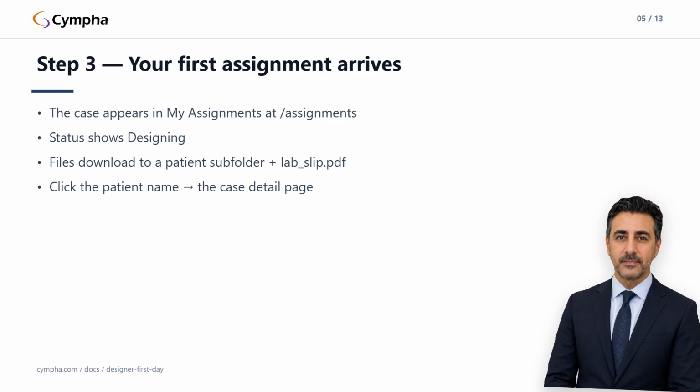That's the next slide. Give the case detail page a full minute. It repays it. The case parameters are what the doctor actually specified: plan ranges, extractions, materials, anything category specific. The file section lists the raw scans the customer uploaded. The agent already has them on your disk.